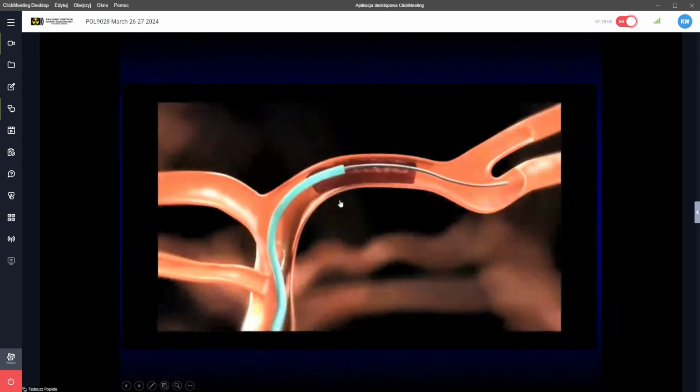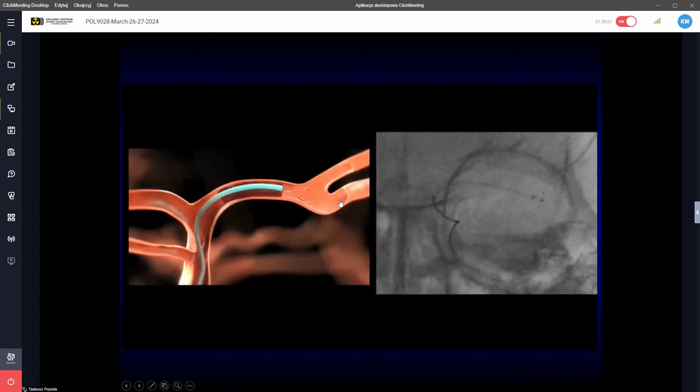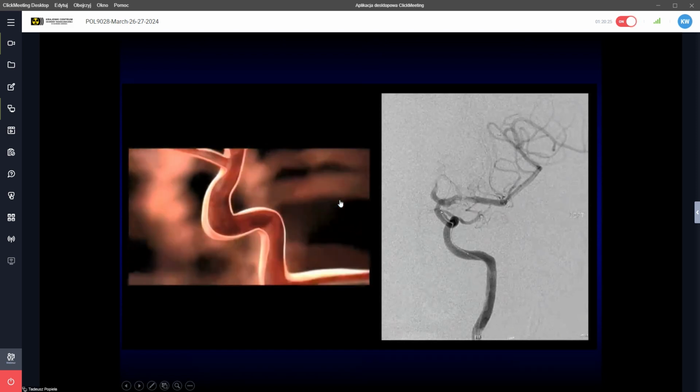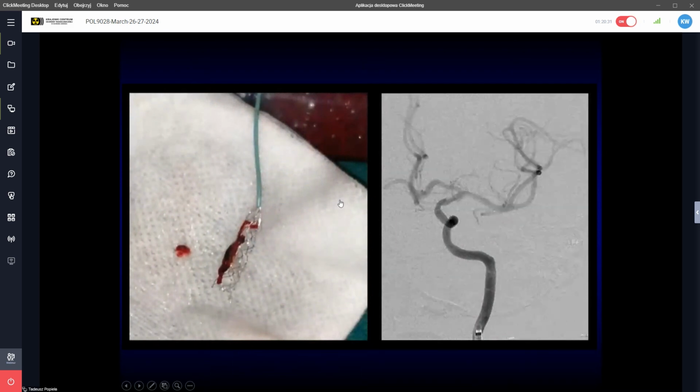And the second one, as Professor Balecki already showed, is with the use of a stent retriever. The stent retriever is a thrombectomy device which is similar in shape to the brain stent. We must pass the clot material and open it just in the center. We can use the contrast to see that we are really in the middle of the clot material with this device, and then we can remove it with the open thrombectomy device. This is in the hope that the clot will be attached to the metal structure of the thrombectomy device.